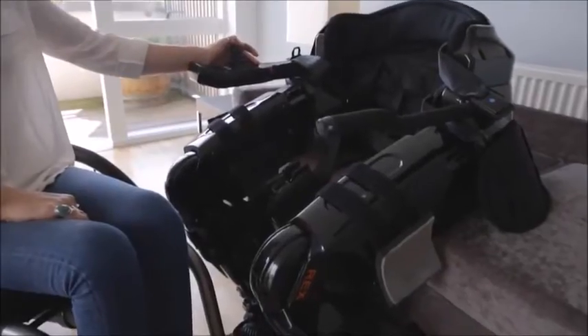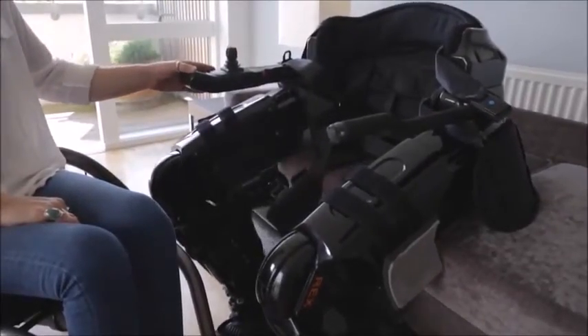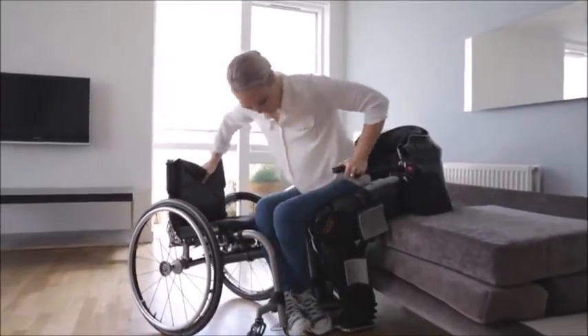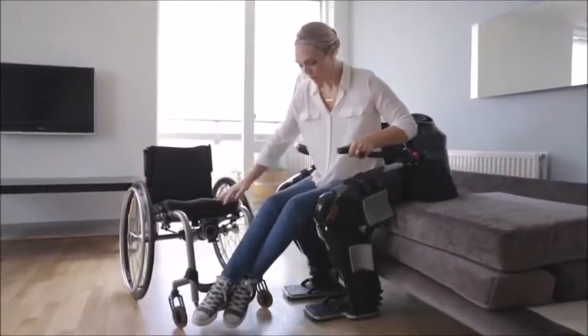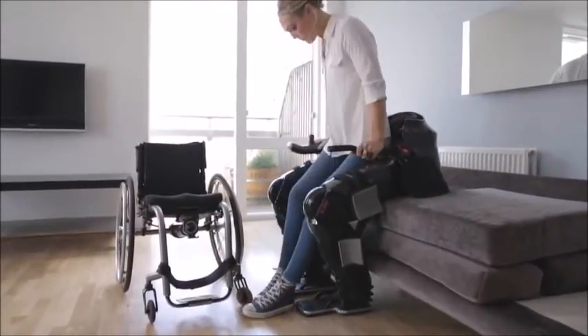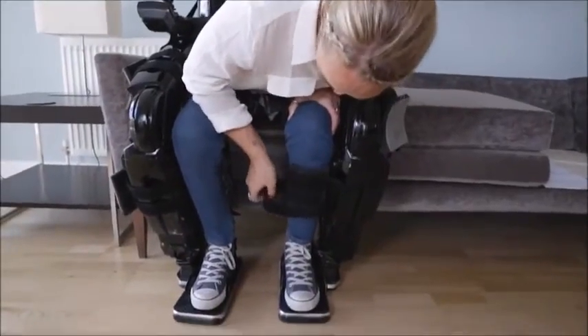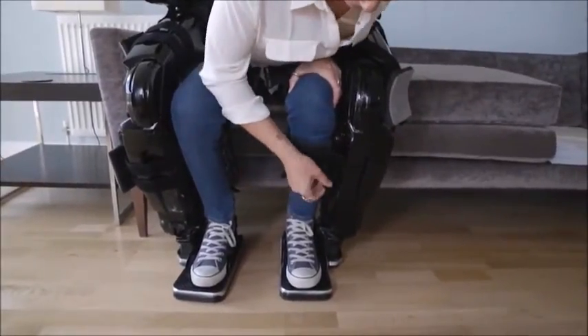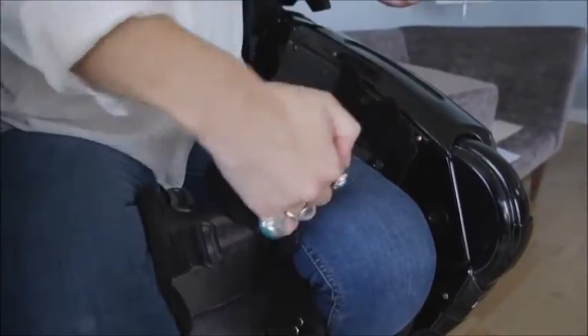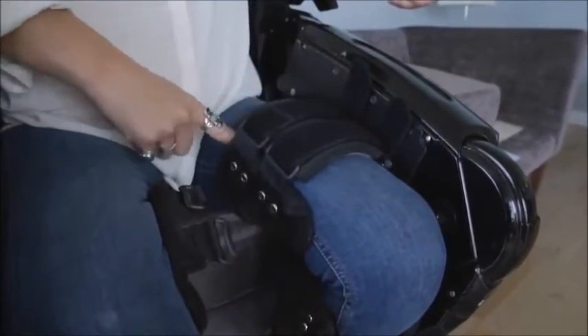To transfer, I simply open Rex's legs. I can position my chair next to Rex and transfer myself into the exoskeleton. Once I'm in and seated as far back as possible, I then fasten the straps around my shins and thighs until they're secure, but not too tight to avoid too much pressure. Also, the pads are soft and flexible and can be detached and washed. I transfer using this method, but everybody is different. It is possible to use a hoist or assistance to transfer.